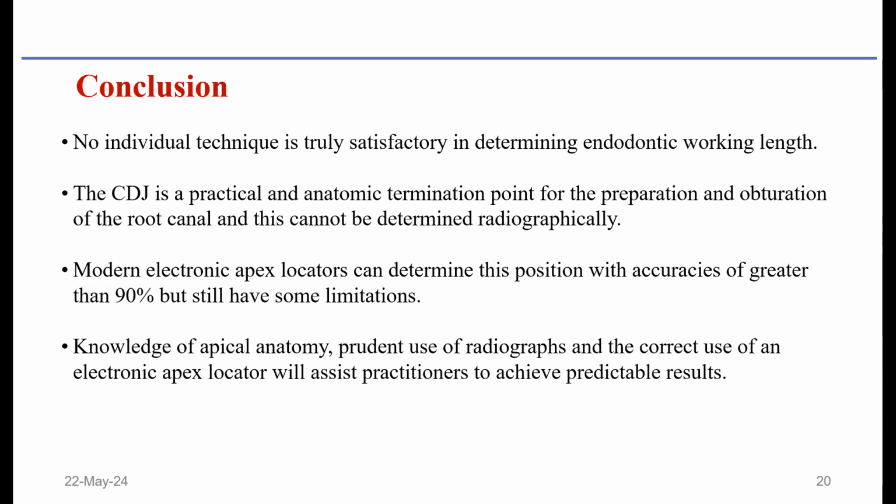So coming to the conclusion, no individual technique is truly satisfactory in determining the endodontic working length. The cemento-dentinal junction or the apical constriction is a practical and anatomic termination for the preparation and obturation of the root canal, and this cannot be determined radiographically. Modern apex locators can determine this position with accuracies of greater than 90%, but still have some limitations. And the knowledge of apical anatomy, prudent use of radiographs, and the correct use of an apex locator will assist practitioners to achieve predictable results.